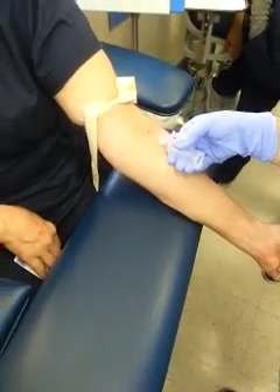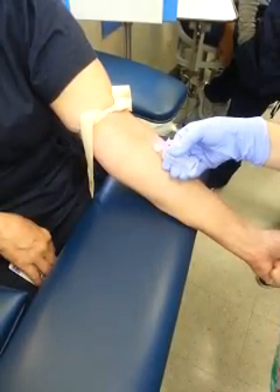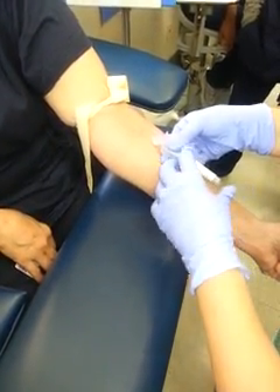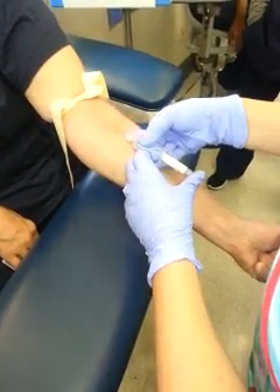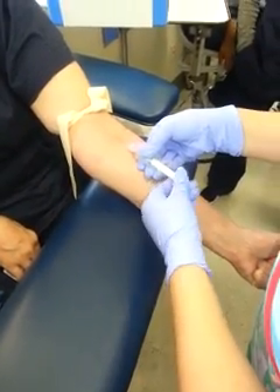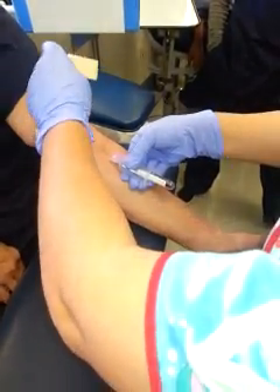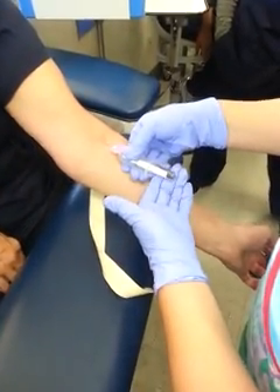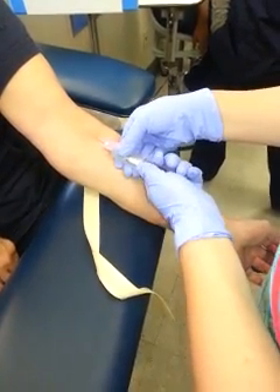If a little blood comes out, grab some gauze and gently dab it so you can see your site. Go ahead and insert the tube using your phalanges — do the peace sign up here and your thumb at the bottom — and insert. Look at your tube, release your fist, release the tourniquet, making sure your eye is always on the needle.